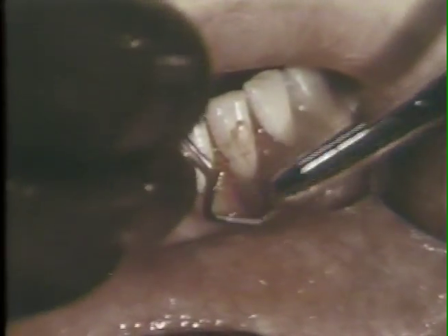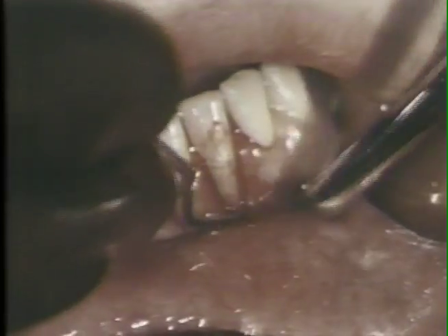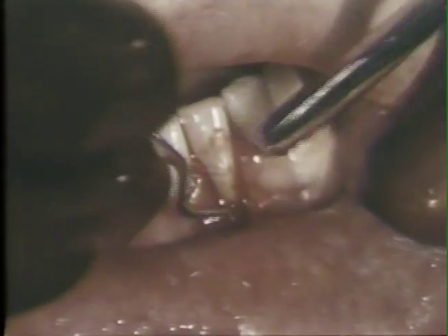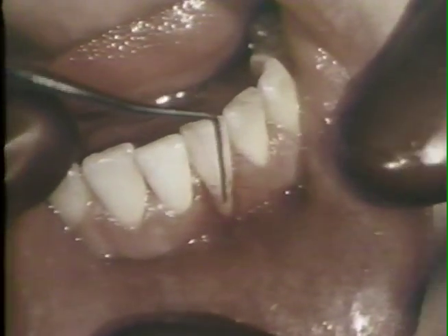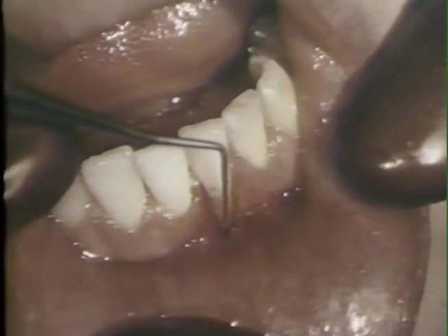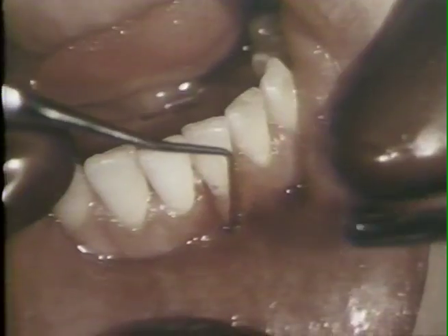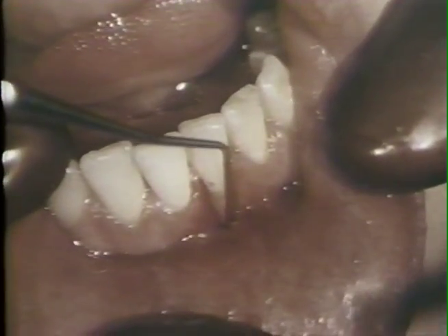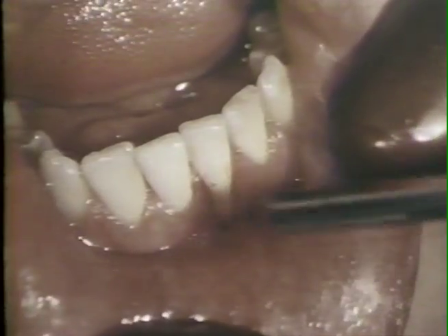The root surface is also curetted to remove surface accretions and to eliminate some of the labial protrusion of the root. The denudation of the root in the curetted area extends three millimeters apically to the mucolabial fold and nine millimeters apically to the cementoenamel junction.